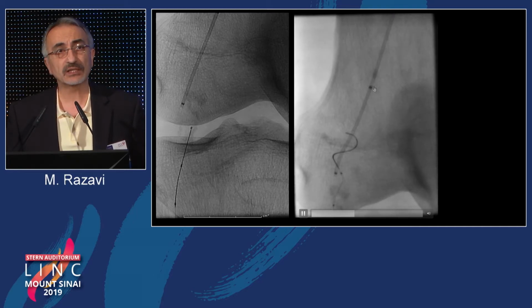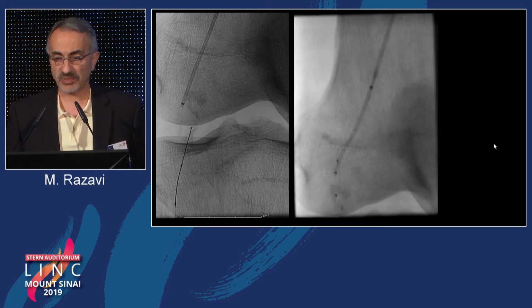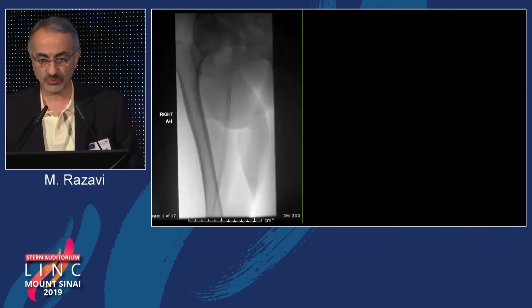What you just saw Dr. Schmidt do is actually pretty good. He angioplastied the occluded lumen up here, and that gives you some room to come in a retrograde fashion, just like you saw right there, where the wire just passed into the lumen that had been angioplastied from the top. And this is what the results are.